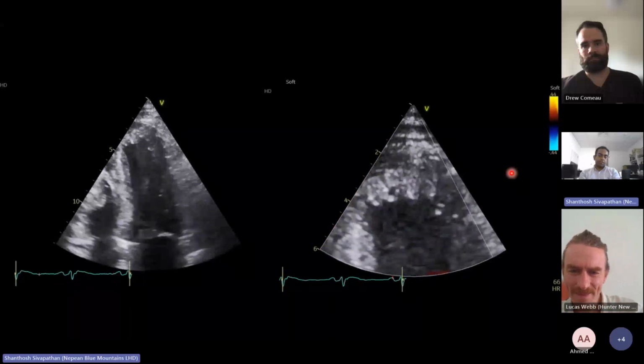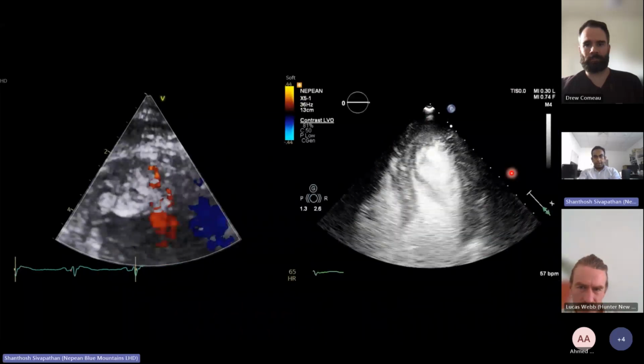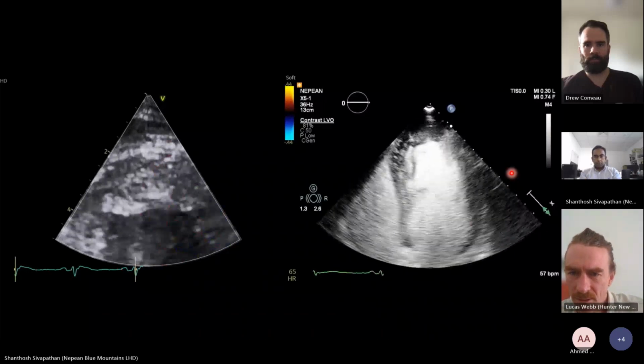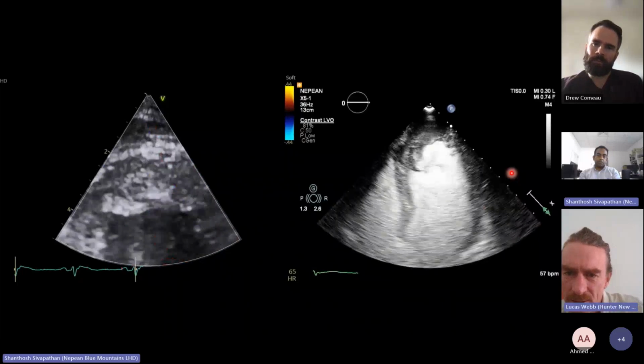Absolutely. And I think the key thing that you said was that you need contrast, right? I'm not sure what I have. And then they're just doing a bit more color there. What about now? Do you think there's a thrombus there now?